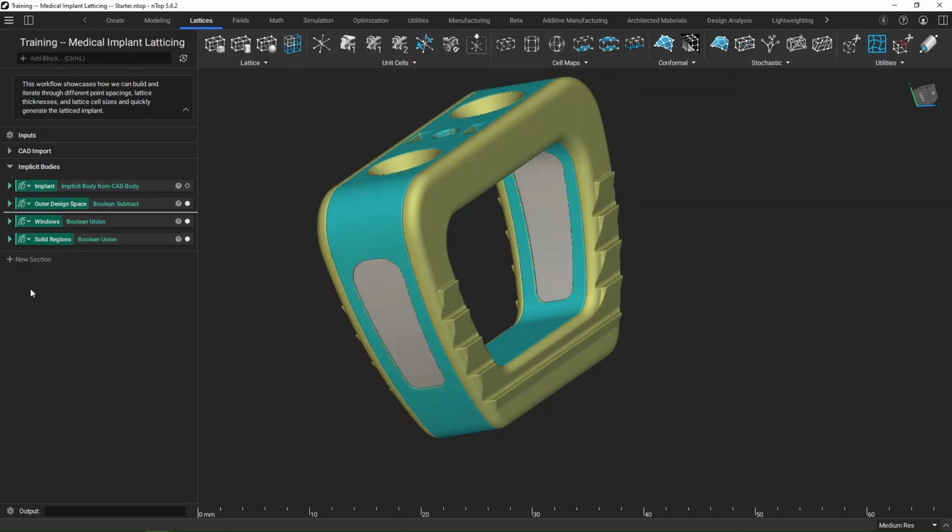So you already have these 2 sections ready to go in that starter file. We can just start from here. I'm going to go ahead and create a new section. So I can click this new section button here. Nice to keep our workbook nice and tidy and our notebook organized by using sections. So I'm going to go ahead, rename this. Let's call this the inner lattice. And just so we know exactly what we're doing, I'll type Voronoi in there as well.